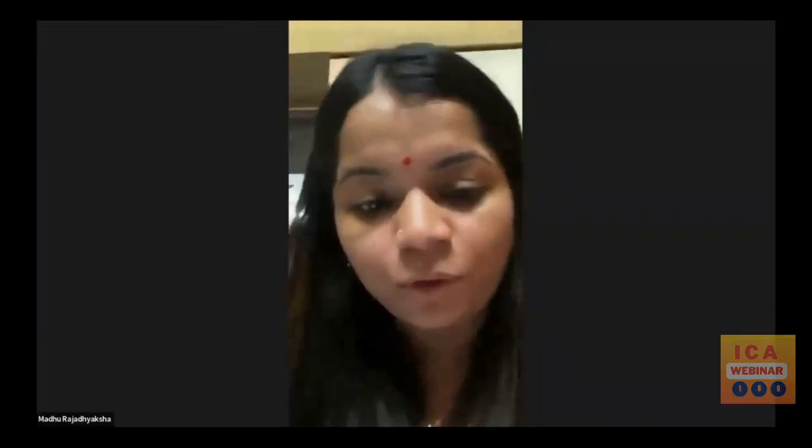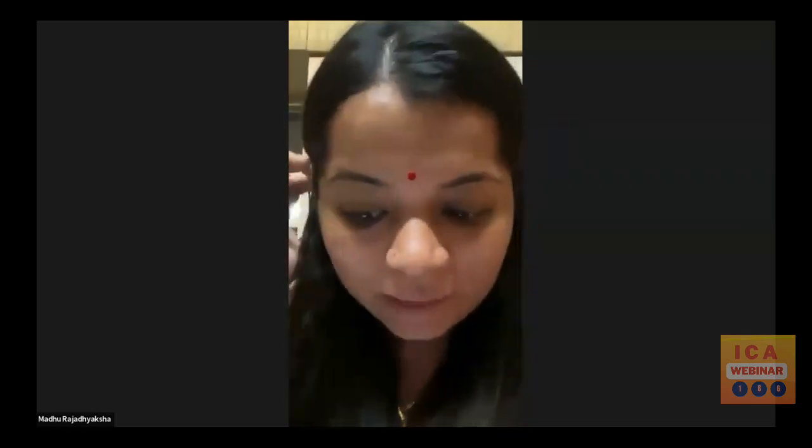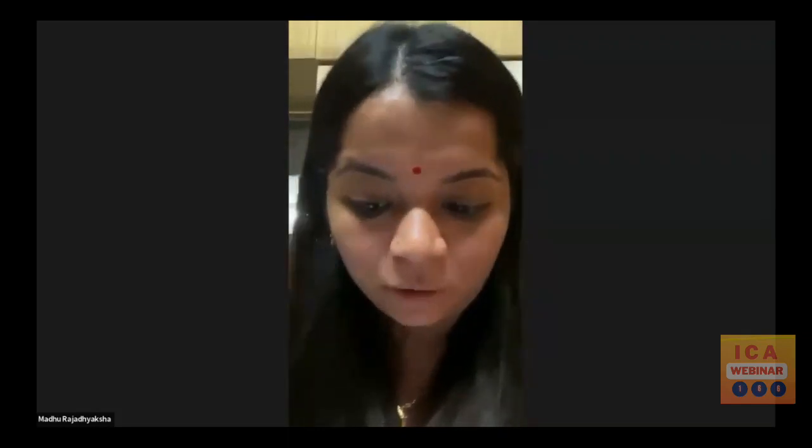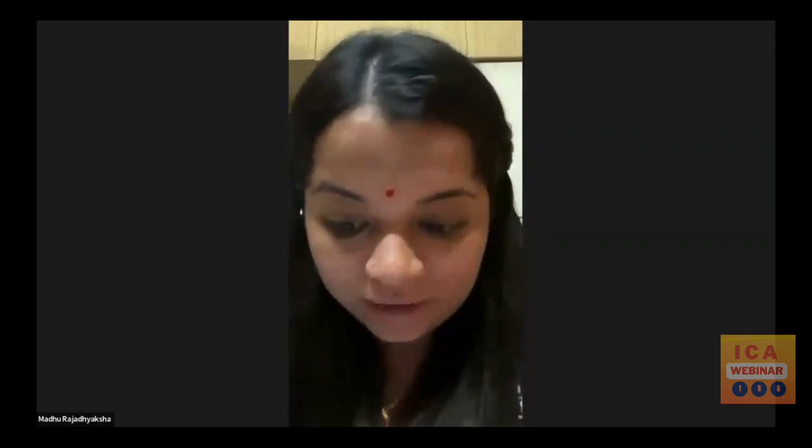There was a question about what is the difference between transpulmonary thermodilution and FloTrac. Yes, in the FloTrac method of cardiac output monitoring, calibration is not required, sir. And it is a continuous cardiac output monitoring. Whereas in PiCCO, we need calibrations, and it is an intermittent method of cardiac output monitoring. But when we add pulse contour analysis to it, continuous cardiac output monitoring can be done.